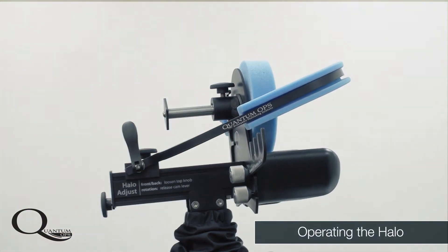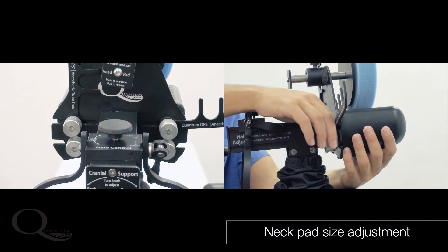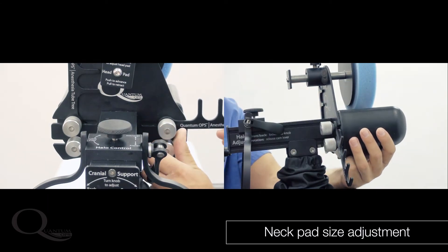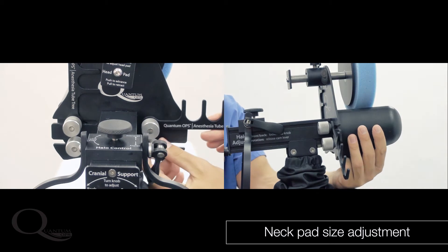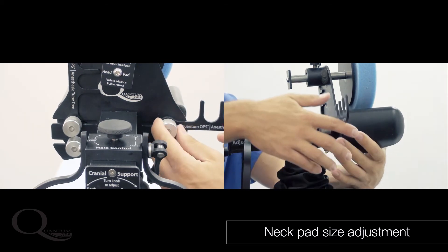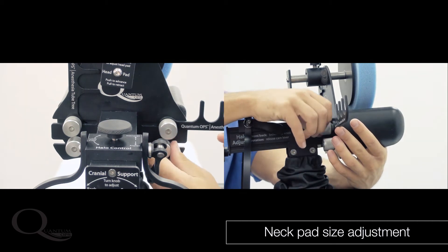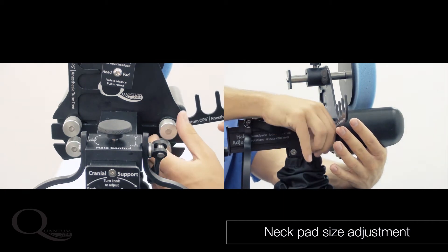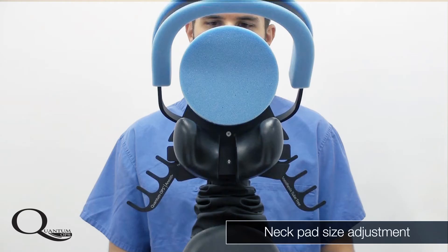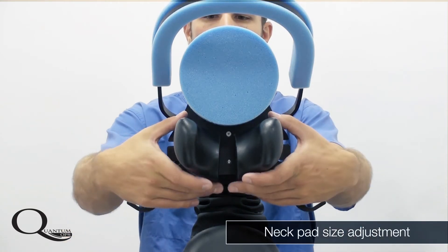This means the surgeon and staff no longer have to worry about the head being dislocated during a case. The neck pad should be adjusted after the patient is elevated to the operative position — loosen the knobs on the back of the pad and adjust laterally, or tilt toward or away from the patient, so that pressure is applied on the side of the neck by the pad. If the pads are not tight enough, the head or neck may shift or slip during the procedure.